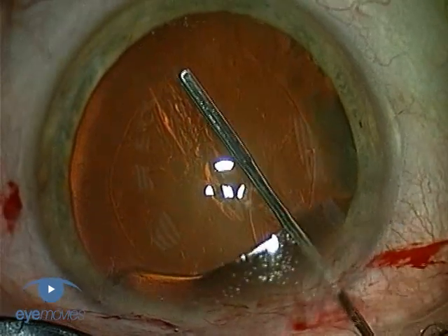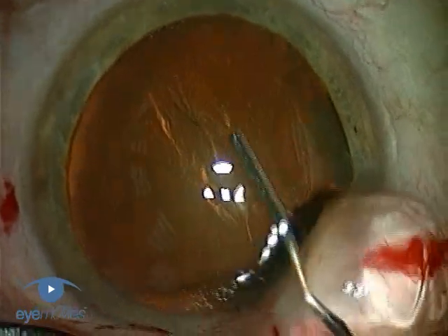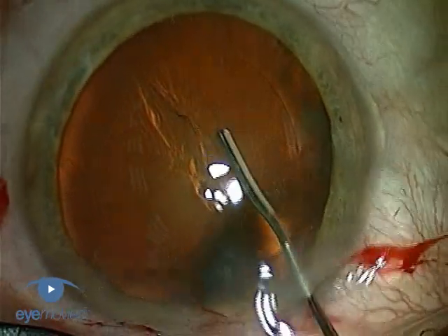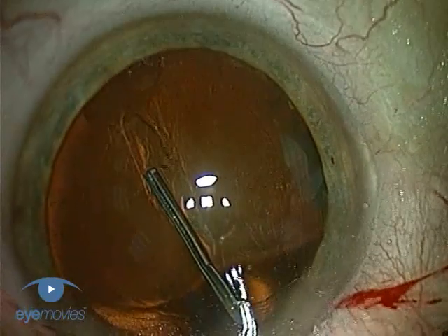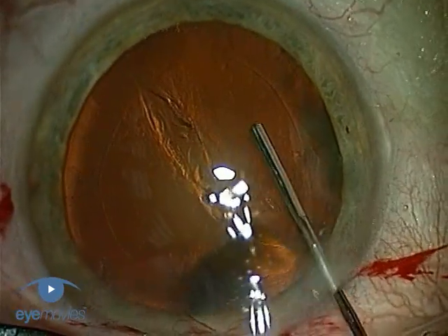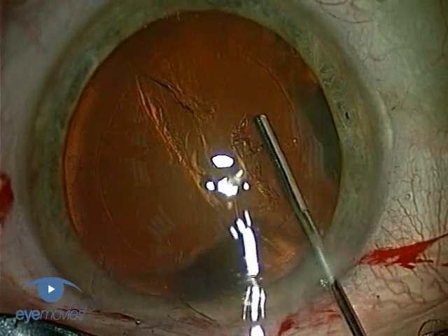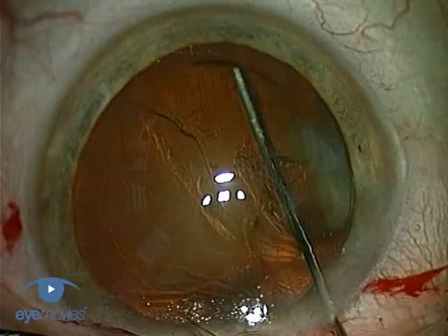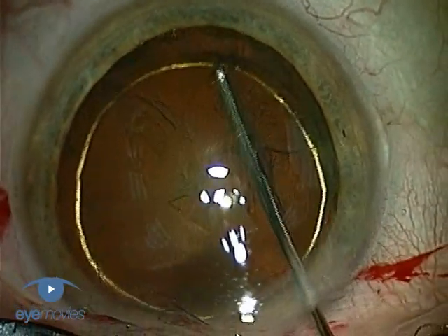Many surgeons like to begin by displacing the viscoelastic out of the chamber before making any attempt at either of the hydro manoeuvres. It's not essential to do this, but it may allow the easier flow of fluid around the lens by reducing the outflow resistance as the fluid comes out of the bag.